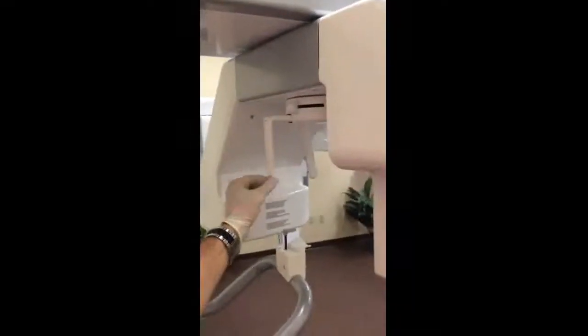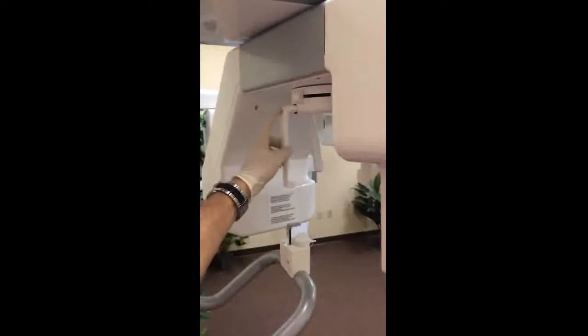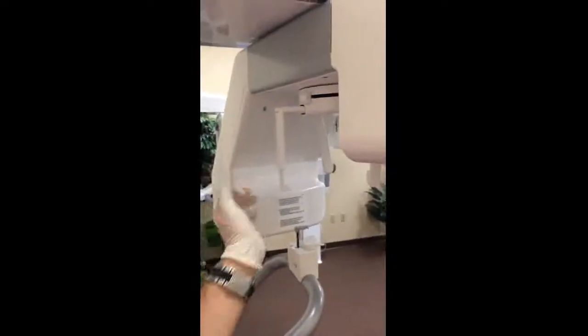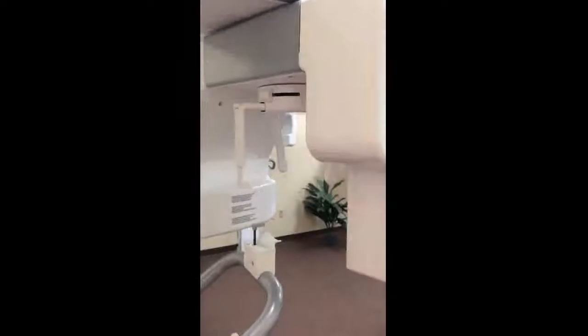For your Nasion support, it moves up and down freely and pushes in freely. You must push the button at the top to slide it towards the mirror. You always want to start with this all the way towards the mirror before you put a patient in. The temple supports are adjusted by this knob here. You want to make sure those are all the way open before you put a patient in. At this point, we'll show you positioning on a patient.